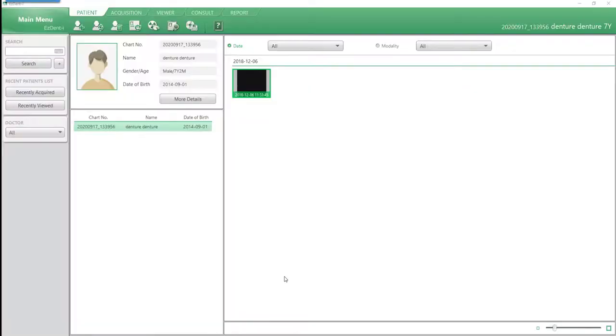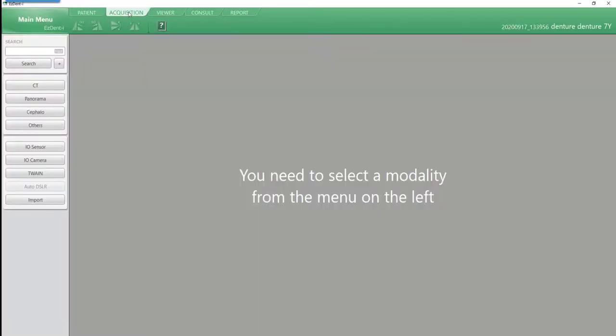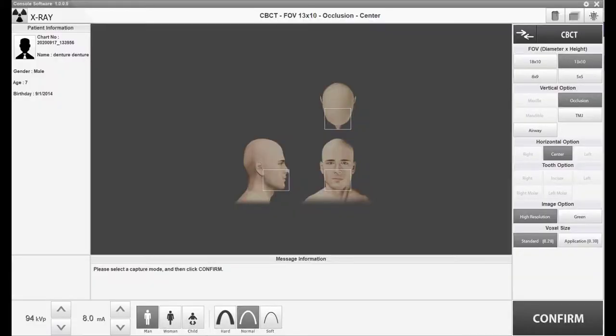From the EZNi software, ensure the proper patient is selected. Next, navigate to the Acquisition tab and select CT.